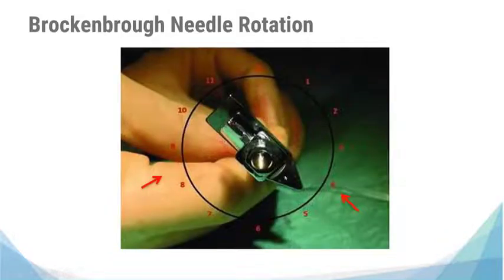So you see here the needle indicator is oriented at 4.5, between 5 and 4. But then, as I told you before, sometimes the angle between the interatrial septum and the back of the patient is narrower. So we have to rotate a little bit more the needle indicator, and you can go even to 7 or 8 o'clock if the fossa ovalis is very much posterior.